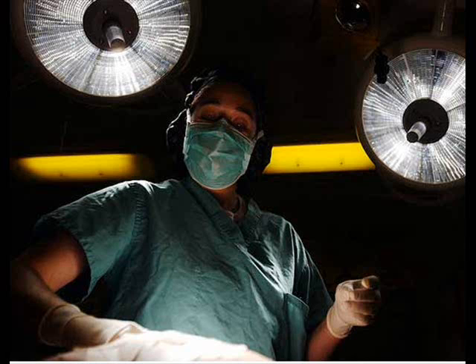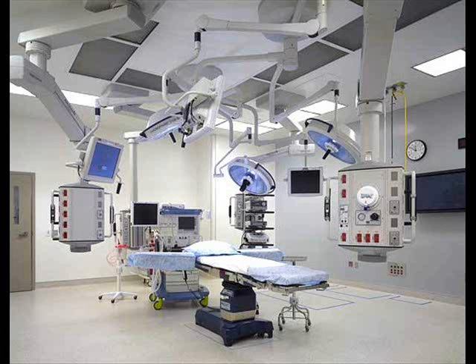Urology. Robotic surgery in the field of urology has become very popular, especially in the United States. It has been most extensively applied for excision of prostate cancer because of difficult anatomical access. It is also utilized for kidney cancer surgeries and to lesser extent surgeries of the bladder. As of 2014, there is little evidence of increased benefits compared to standard surgery to justify the increased costs. Some have found tentative evidence of more complete removal of cancer and less side effects from surgery for prostatectomy.